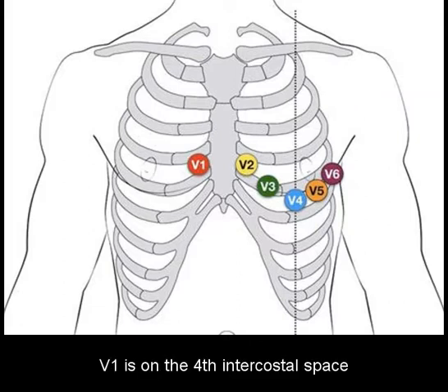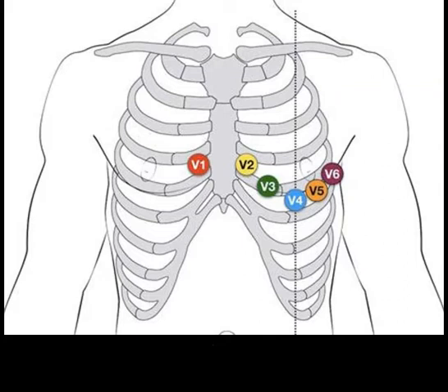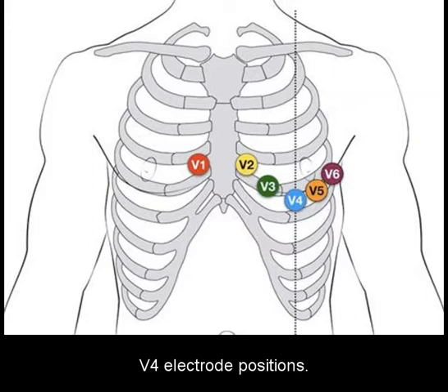V1 is on the fourth intercostal space at the right sternal border. V2 is on the fourth intercostal space at the left sternal border. V4 is on the fifth intercostal space at the left midclavicular line. Next will be V3, midway between the V2 and V4 electrode positions.